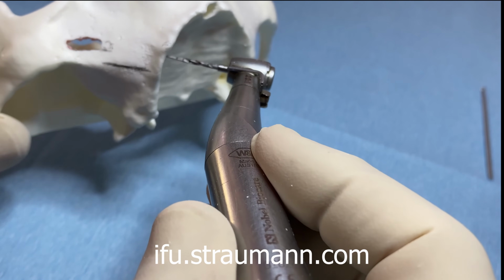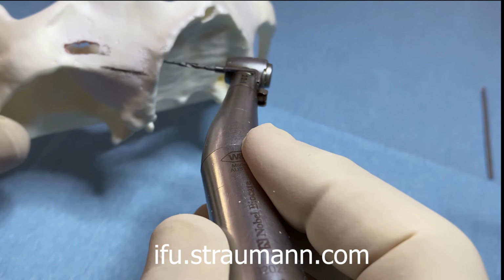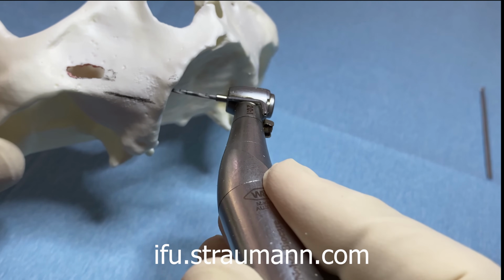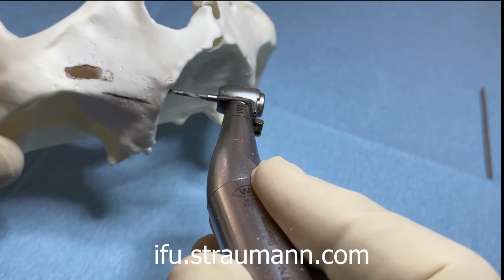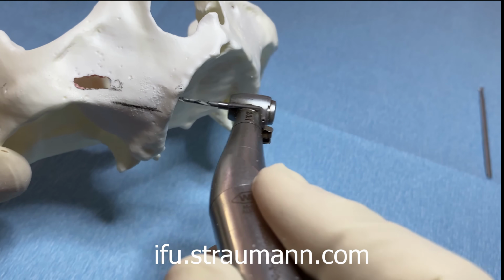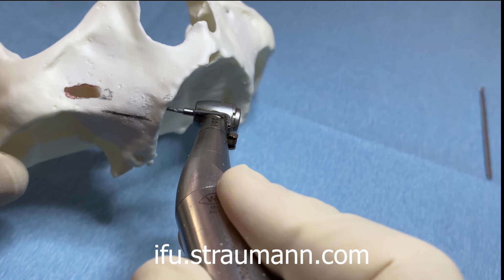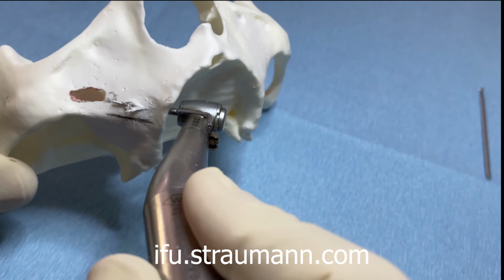our osteotomy, bearing in mind the trajectory that we wanted, and we're going through the alveolar portion, following the black dotted line or the posterior aspect of the window opening. And as you can see, I'm still traveling through. In the real patient, obviously that's not plastic, we will enter the sinus much faster, but in this particular case, there we go.